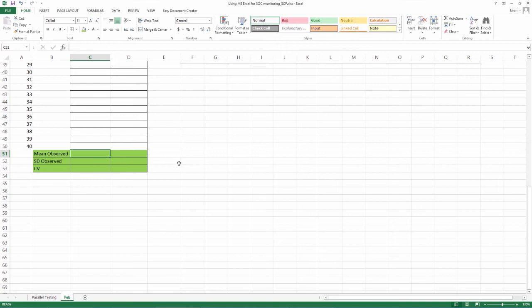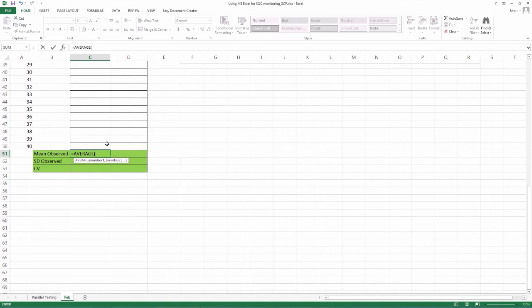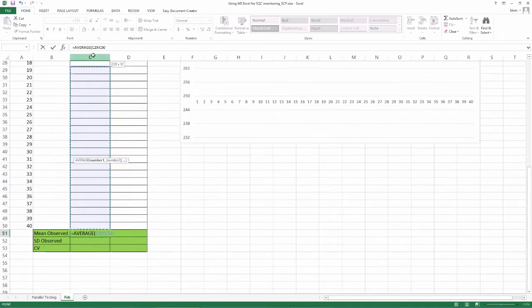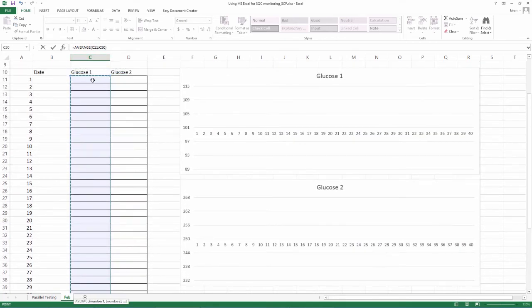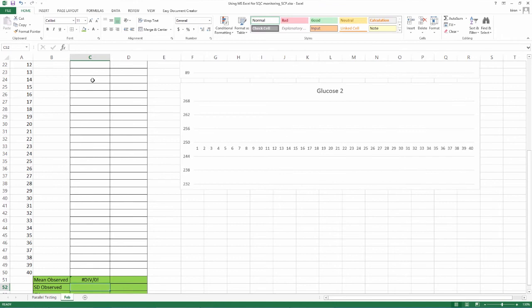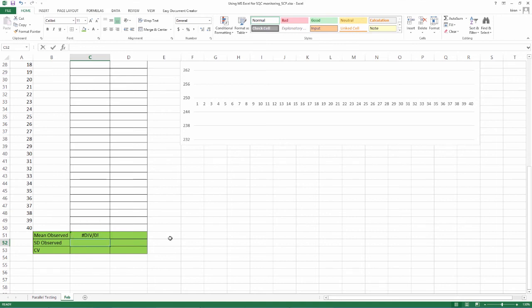Against observed mean under the glucose 1, insert equal to, click average, open bracket, select cells from run 1 to 40, close bracket and press enter. Since there is no value input at this point and only formula is present, you will see error code hash div by 0. As values are fed in, the calculation will automatically be enabled.